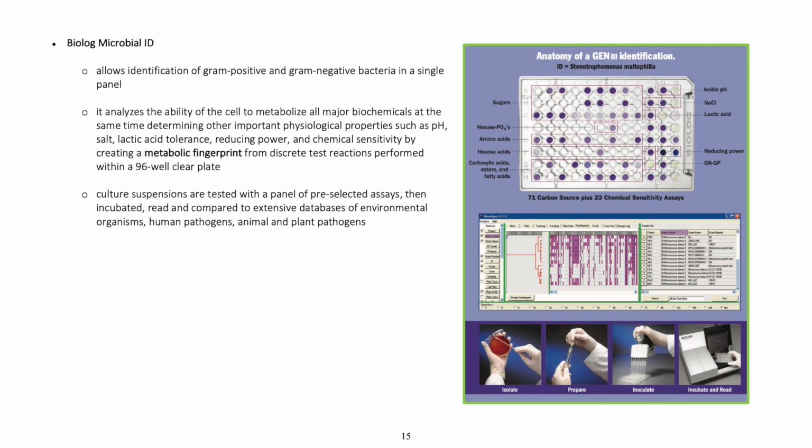Culture suspensions are tested with a panel of pre-selected assays, then incubated, read, and compared to extensive databases of environmental organisms, human pathogens, and animal and plant pathogens.